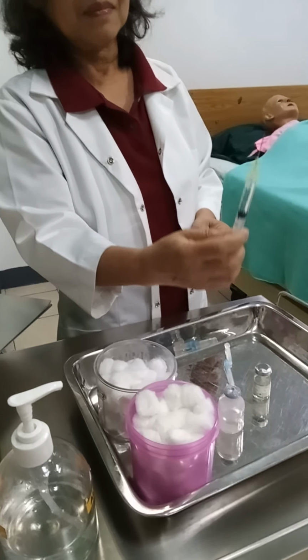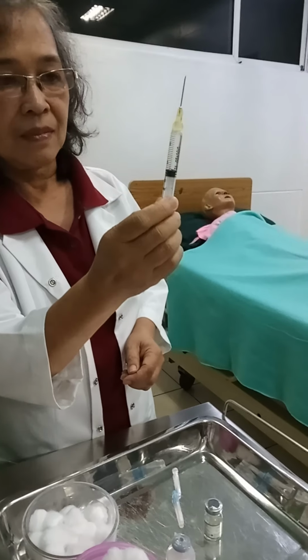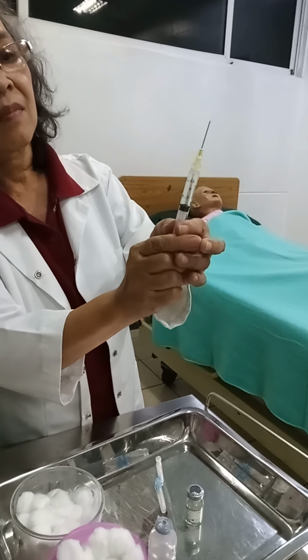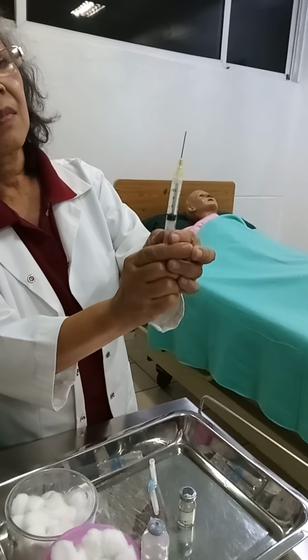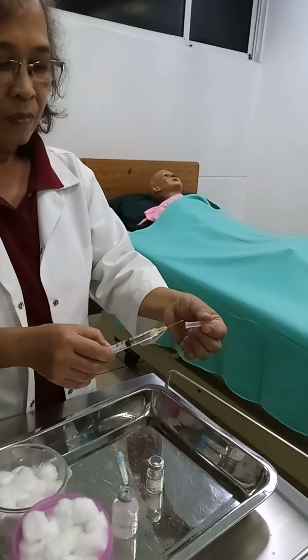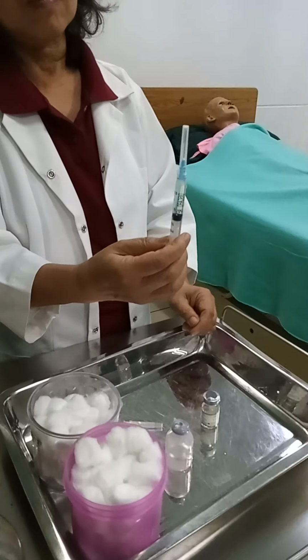Alright, so we hold the syringe upright at eye level and ensure correct volume and absence of bubbles. Tap the barrel to dislodge any air bubbles. Pull back the plunger slightly, then push air out but do not eject fluid. Again, if medication is to be injected into the client's tissues, then you have to change the needle to the appropriate gauge and length according to the route of medication.